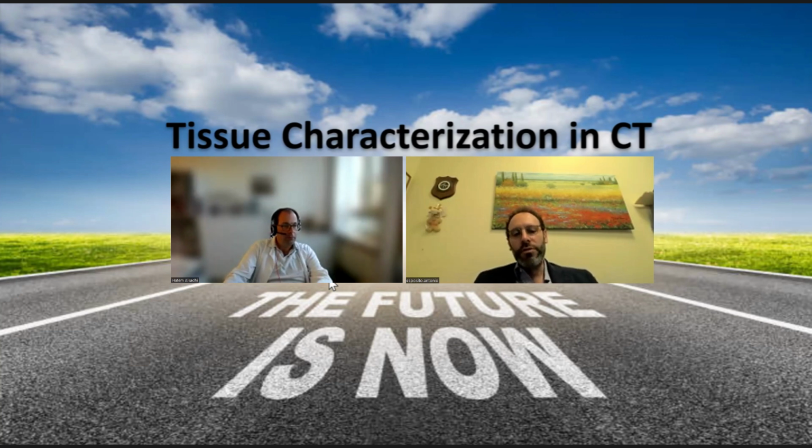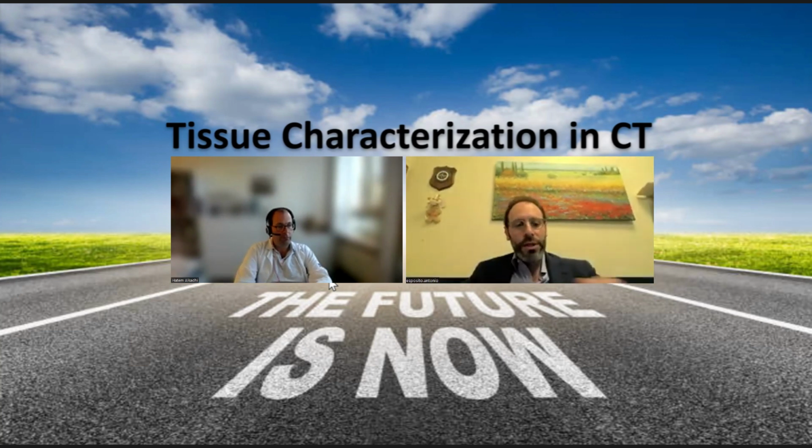And obviously the quality of the scanner, not in terms of number of slices or velocity of rotation, but the quality of the scanner in terms of quality of the detectors. And so obviously a new scanner, it could also be a 64 slice scanner, but with performing detectors, and also the quality of the iterative reconstruction system.